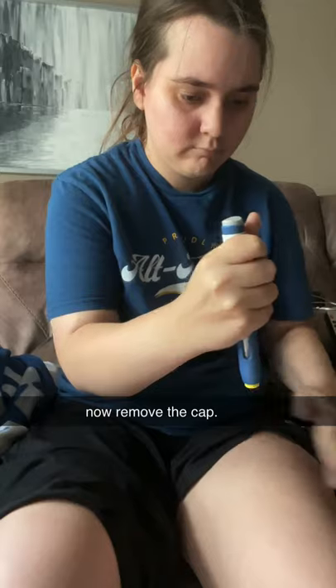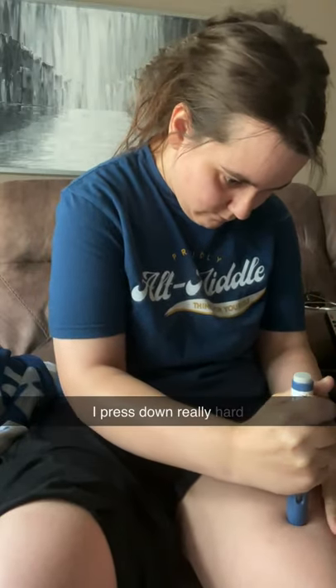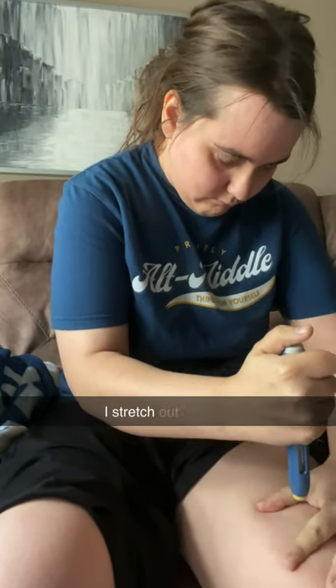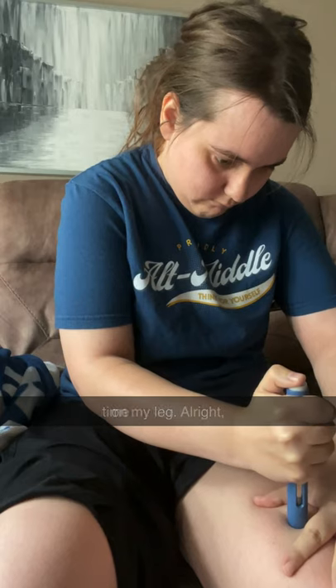So now I remove the cap. I press down really hard because it's got to be hard in order for it to work. And I stretch out the skin on my leg. All right, time for the injection.